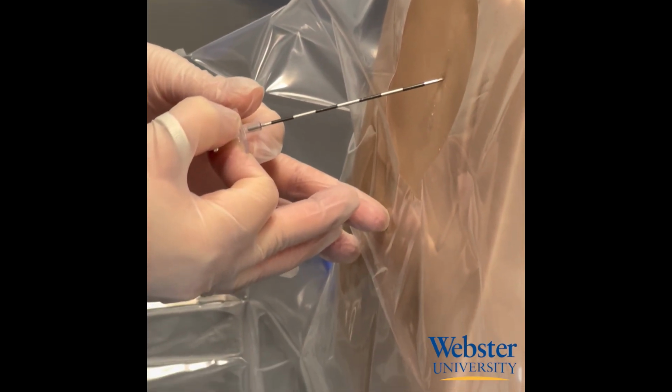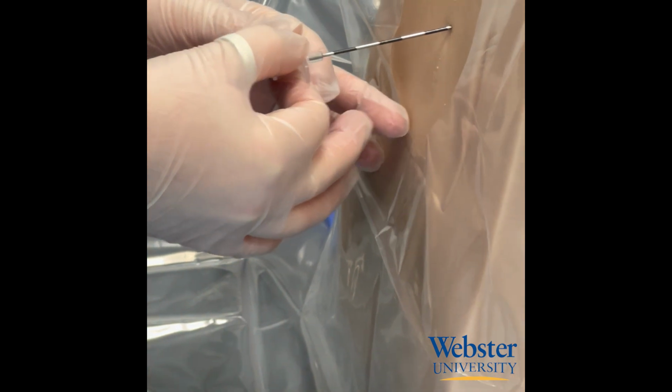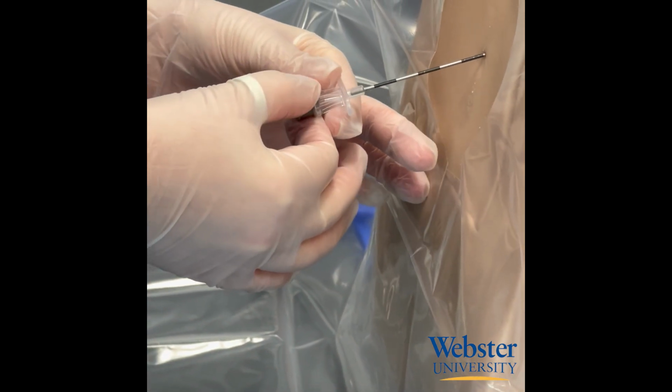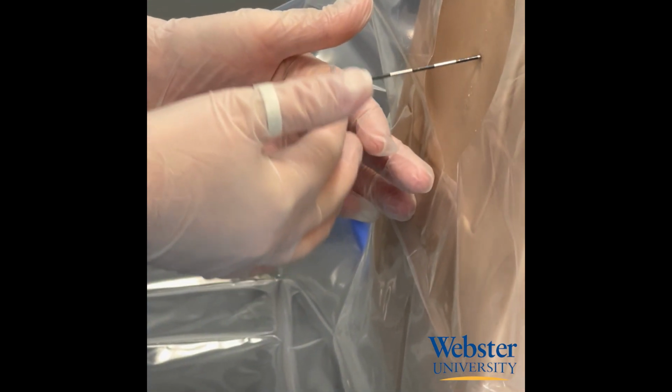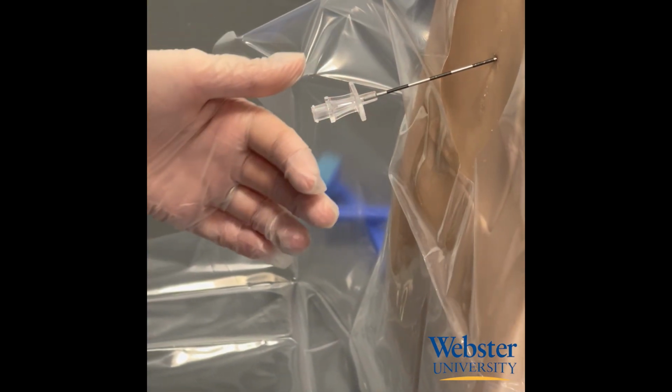Insert your epidural needle until it's pretty snug in the ligaments and you know it's not going to fall out, and then you can take the stylet out and attach the loss of resistance syringe.